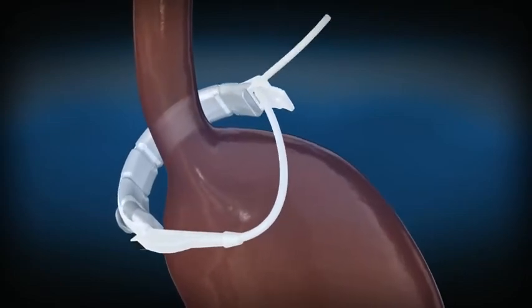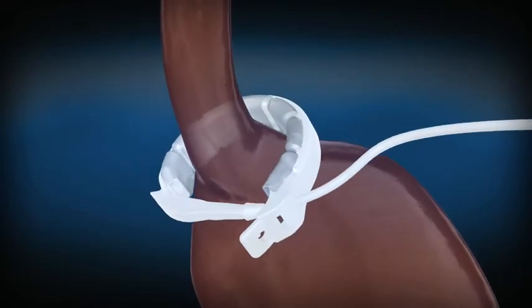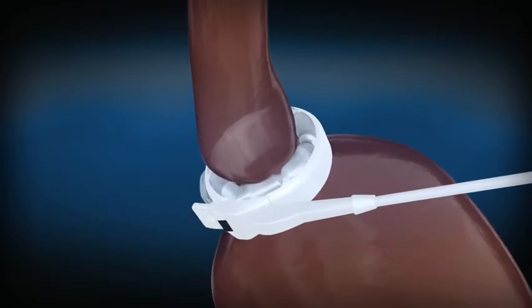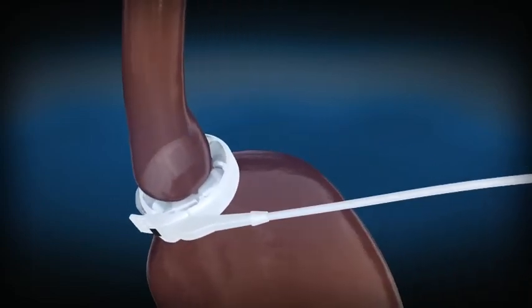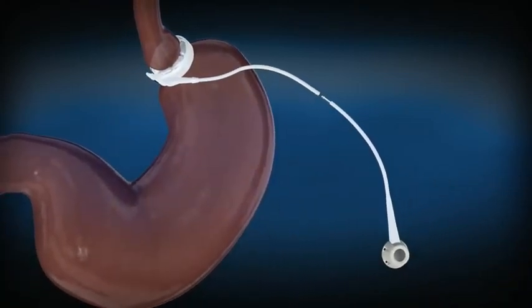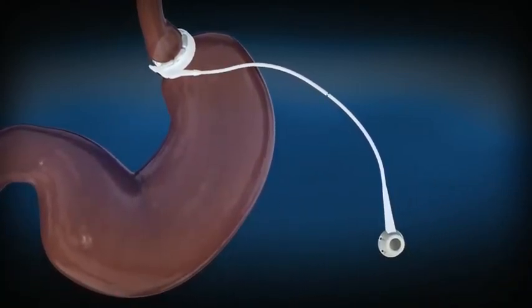This creates a small upper stomach pouch and a narrowed outlet between the new upper pouch and lower stomach. The LapBand system is connected by a tube to an access port fixed to the muscle wall just below the skin of your abdomen.